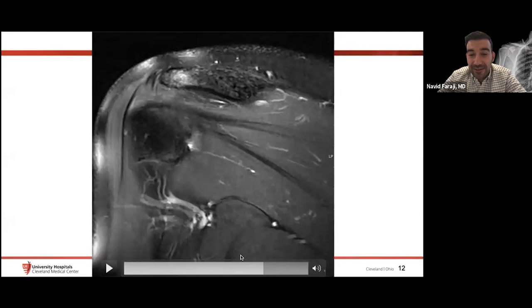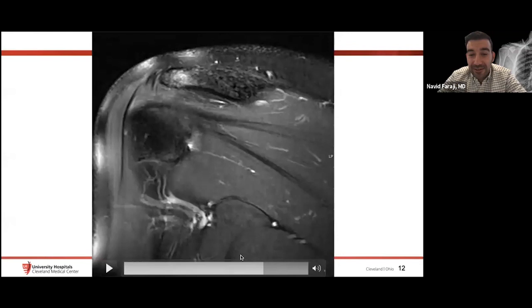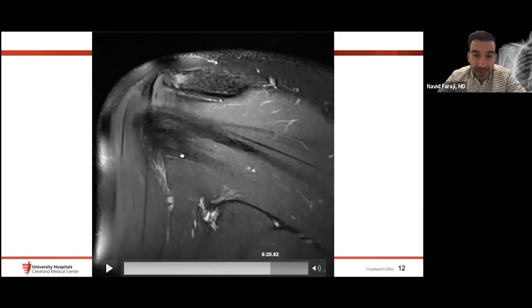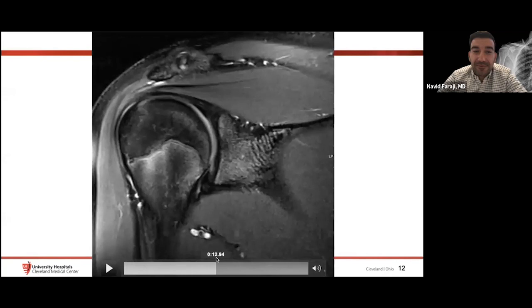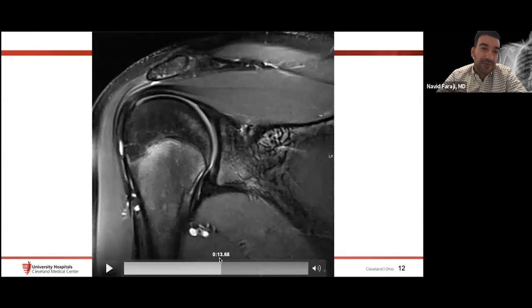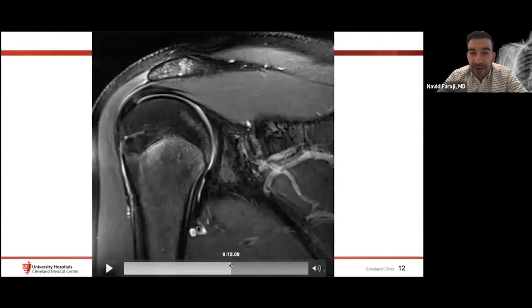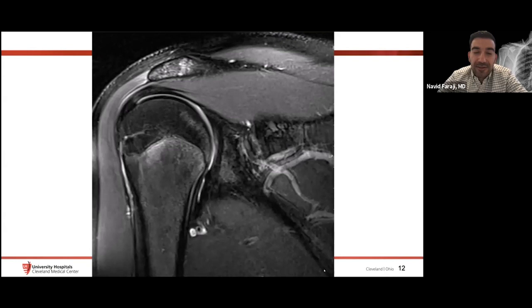As we go more posterior, we see the more obliquely oriented infraspinatus tendon, and then the teres minor tendon. Regarding common disease patterns: supraspinatus tears far more than infraspinatus, which tears far more than teres minor — I haven't seen many teres minor tears. Tears in the greater tuberosity insertions tend to progress anterior to posterior and articular surface to bursal surface. The subscapularis tends to tear from cranial to caudal.